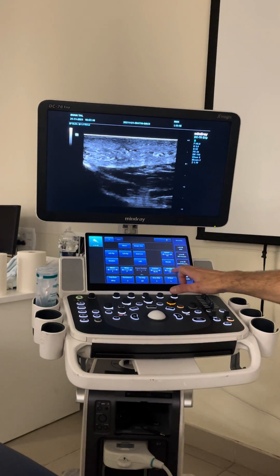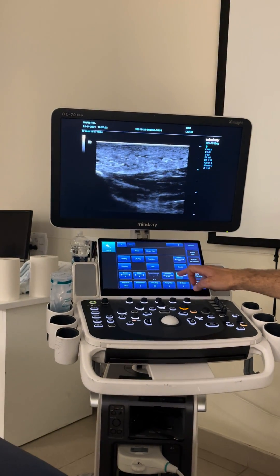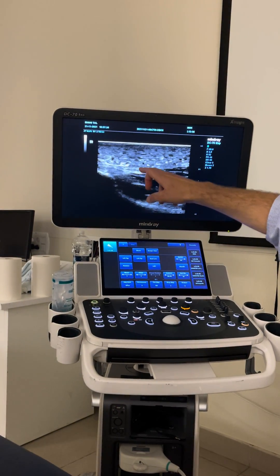Sometimes with the dynamic range, if you put it too high, it's not very clear. If you put it a bit lower, you see a bit more distinction between the layers.